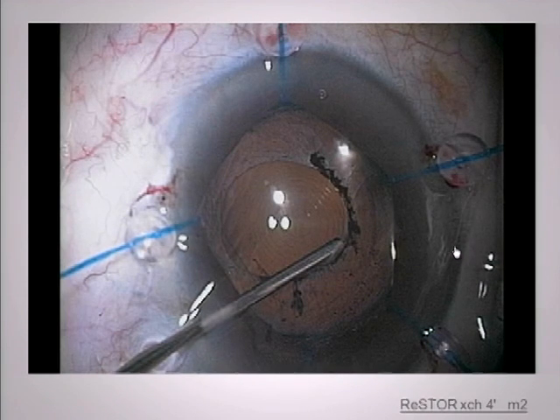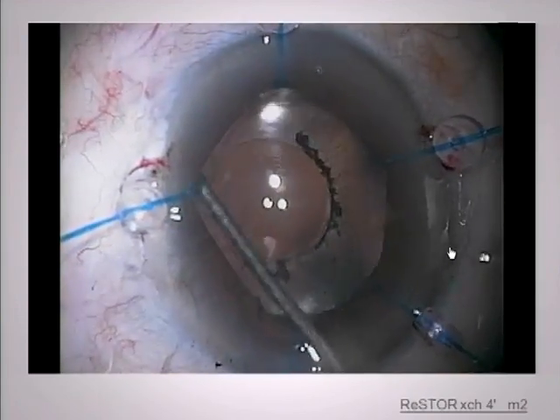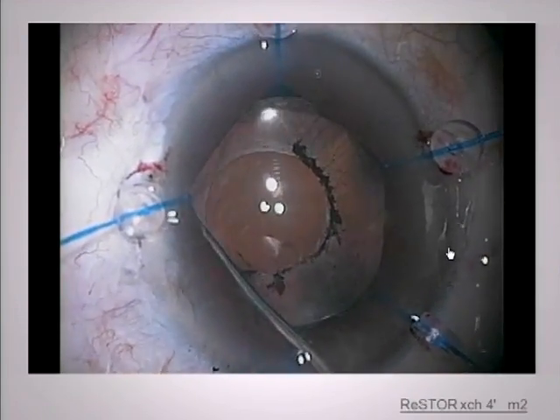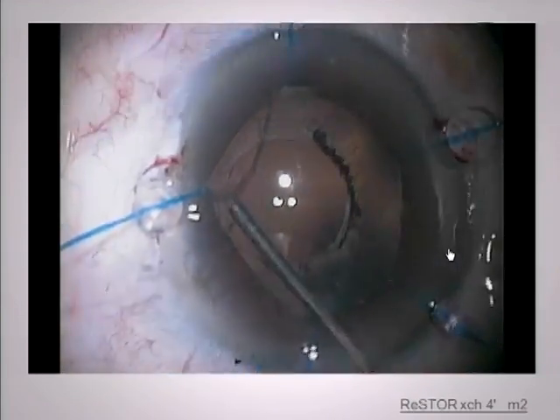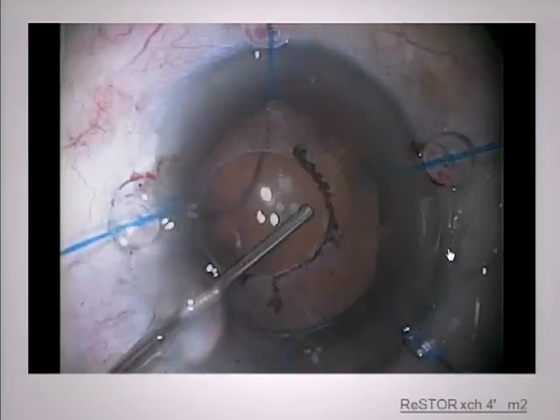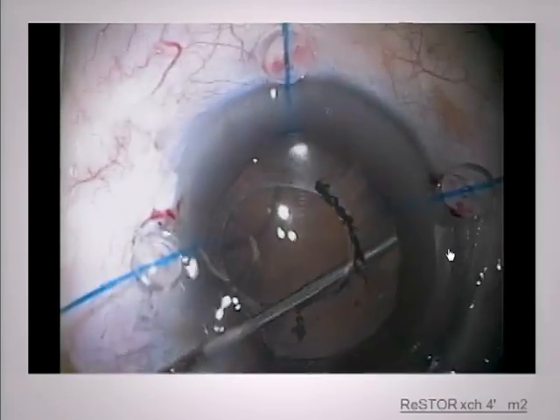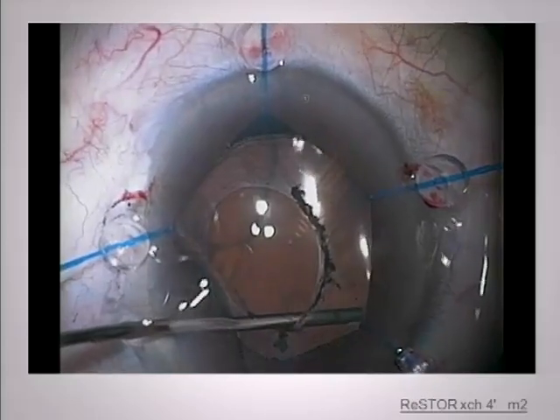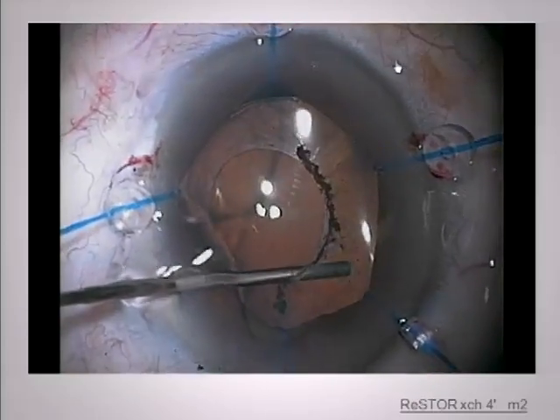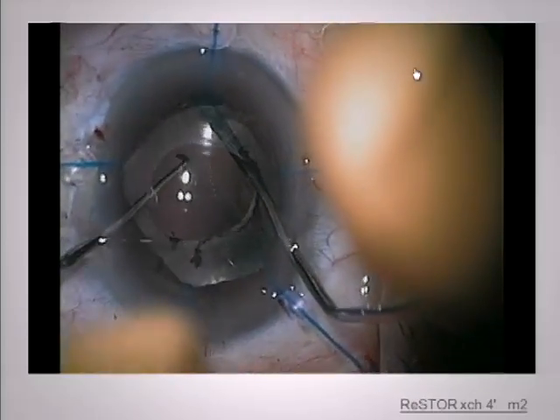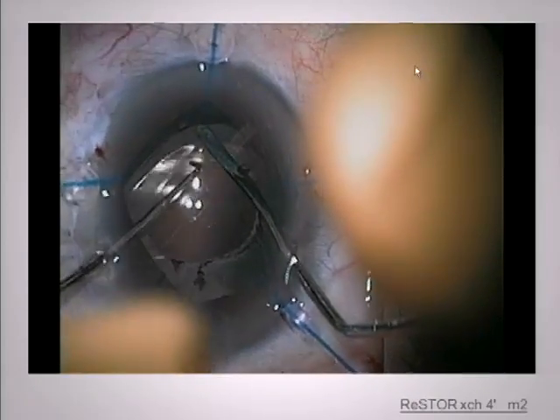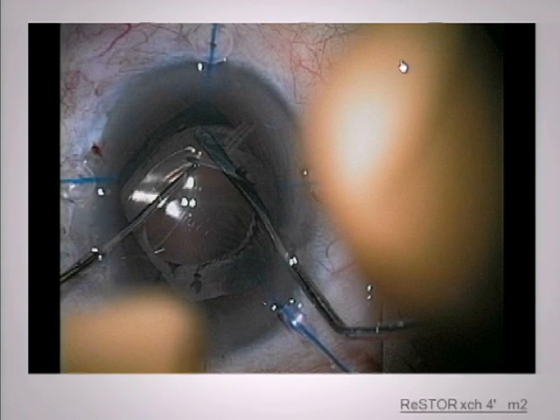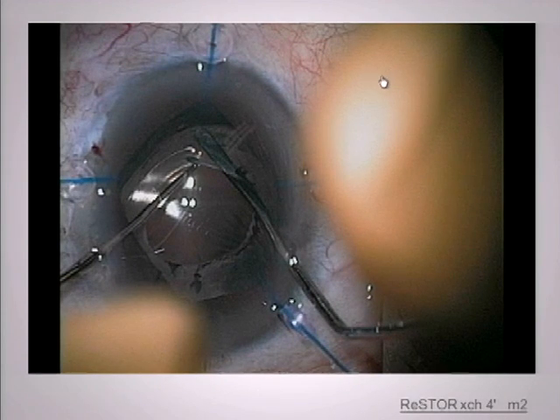I use viscote as well — so that's three for three. I'm coming in all three directions, and I'll use the side port. You may have to burp the chamber from time to time so you don't overfill. What will have happened to the posterior capsule by now is it's pretty much going to be blown out, and you expect that, because there's no circular edge.